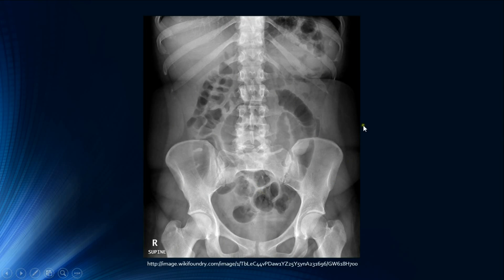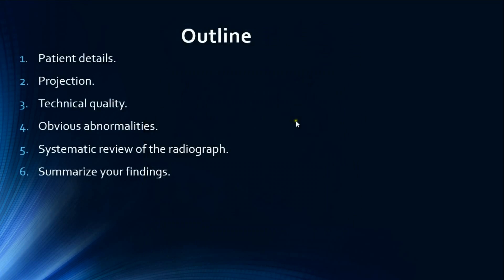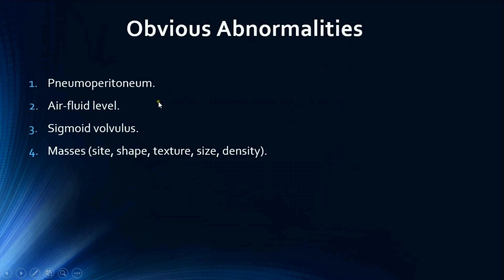Here is an AP supine abdominal radiograph. The hemidiaphragms are not included, making this technically inadequate, whereas the symphysis pubis and hernial orifices are included.